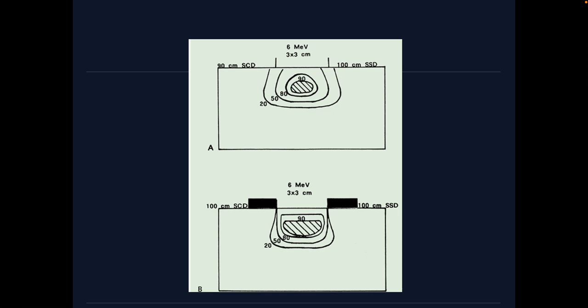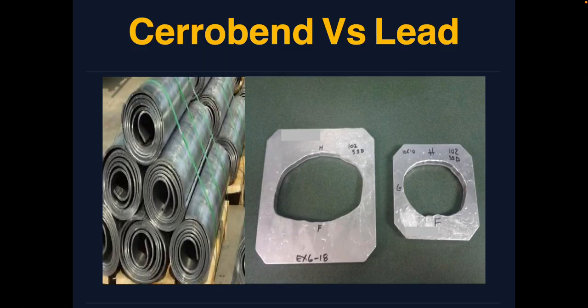You may lose your flatness completely, you may have a severe constriction of the 90% isodose line, and some centers I'm aware of do not allow electron beam fields less than 4 centimeters. So you have to discuss it with your physics team, and please don't forget that in some centers, allowing a 3 by 3 centimeter minimum field size necessitates a collimation on the skin, and this needs full discussion with your physics team. But it's a very tricky and important point.